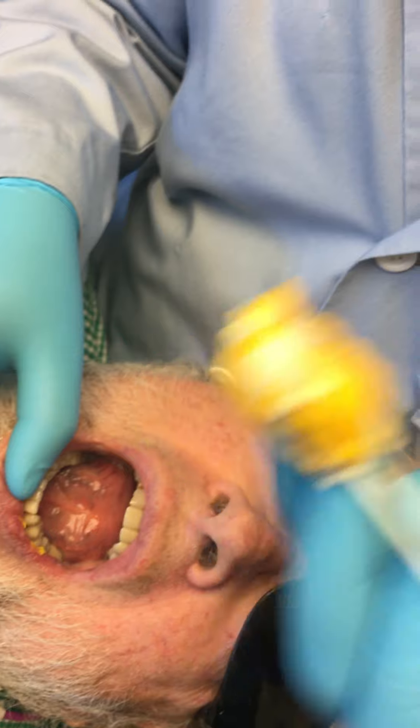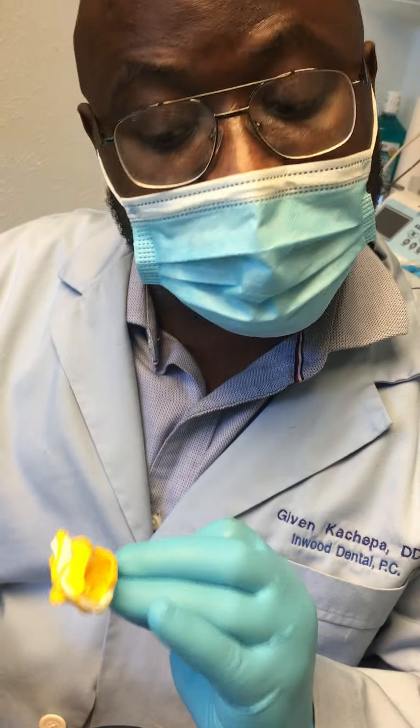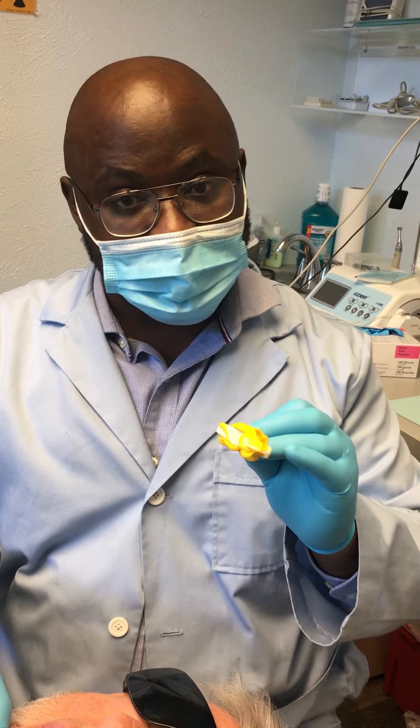And that's the template, and that's what we're gonna use to make it temporary for his teeth after we remove the crown and prep it for a different crown.